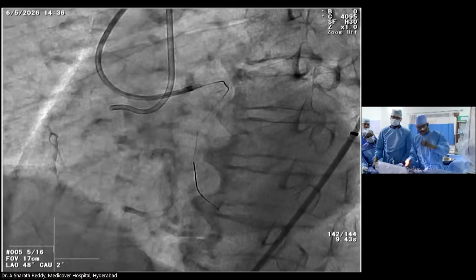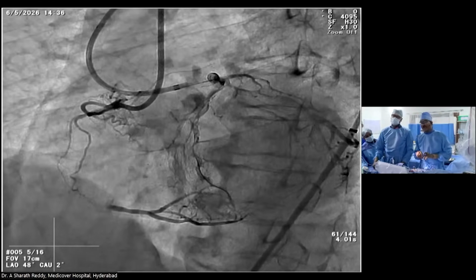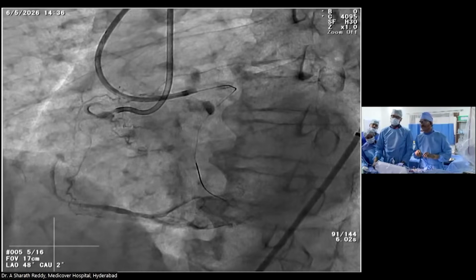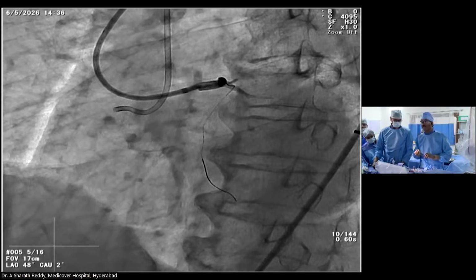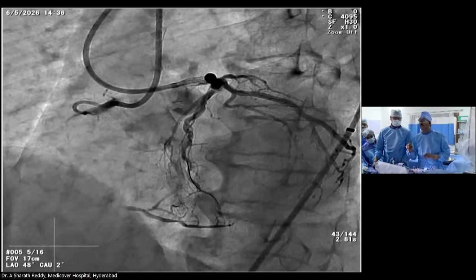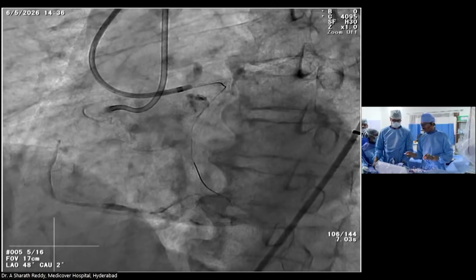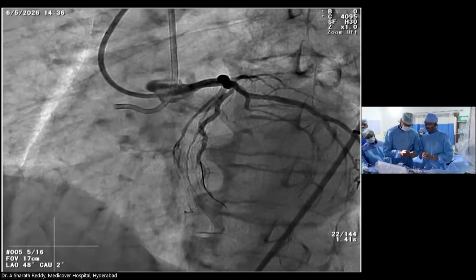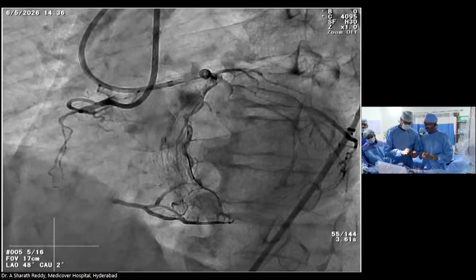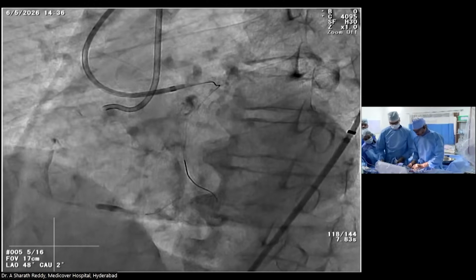It's a teaching point, and also to wait. We see that it takes 3 seconds, or 3 heartbeats, to get to the distal. So always the large lumen injection into the donor vessel makes the CTO shorter. But you had a perfect workup of the case, and let's get some 2-3 opinions on how to approach.